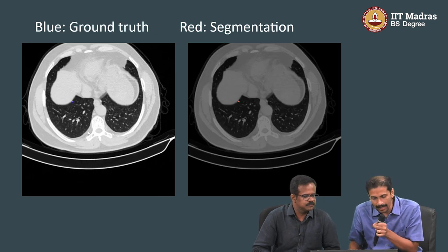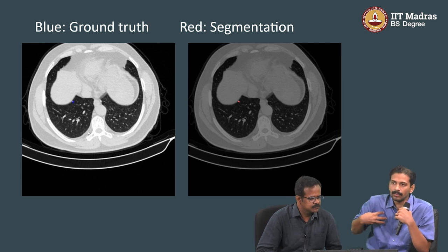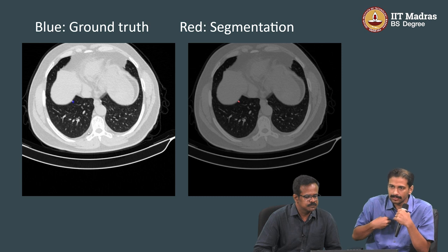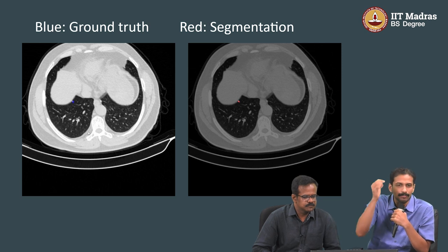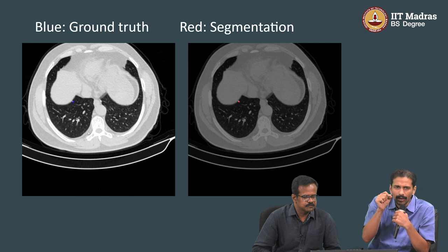And this is another one which again we did with IIT Delhi. Tumors can throw metastasis, spread to the lungs. When they spread to the lungs, they form nodules in the lungs. We wanted to mark those nodules, segment them out. But there are multiple sections and each nodule is a tiny one. It's very difficult to manually mark all those areas.